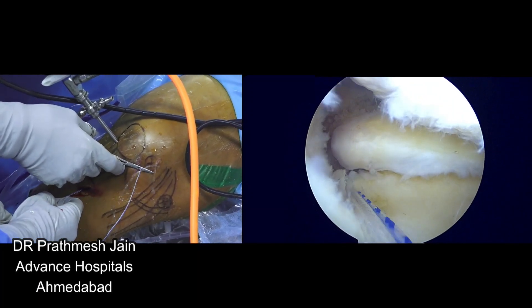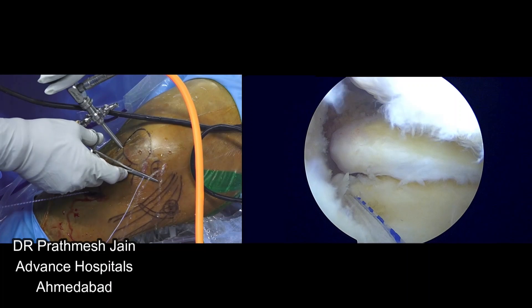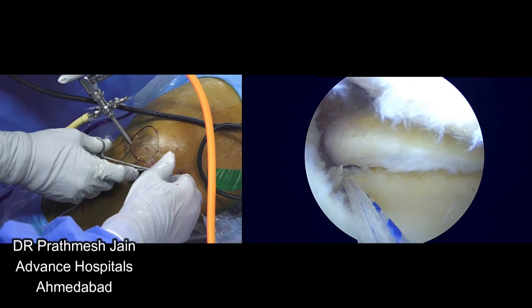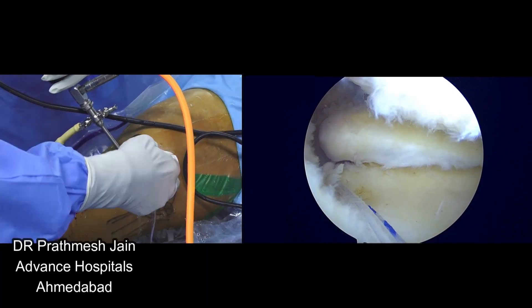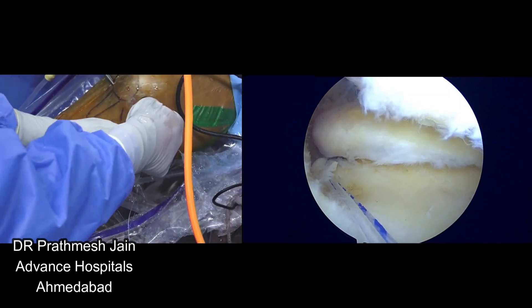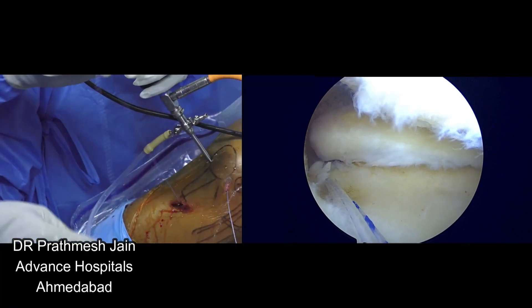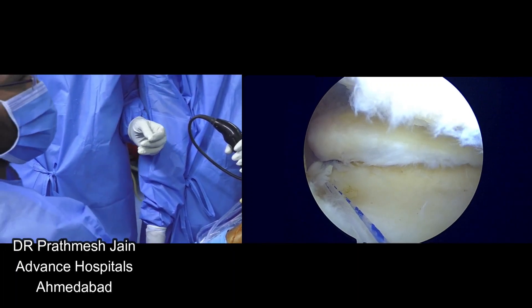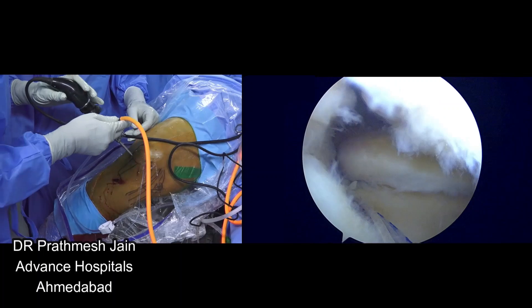Then you ask your assistant to pull it into the tibia — pull, very nice, stop. You can see that it is nicely pulled. So it is very nicely pulled now. You can see that the anchor is placed at the root very firmly. Now you ask your assistant to hold these sutures, and then the pulling suture you can pull from beneath — the anchor is now subcondral and it has four sutures exiting from the anchor.